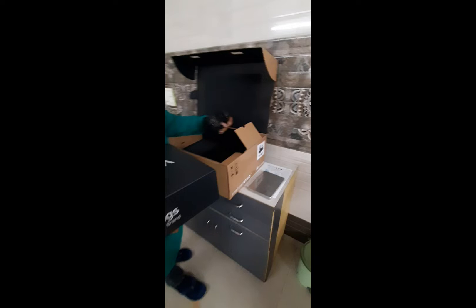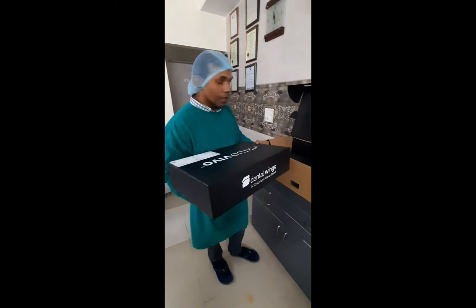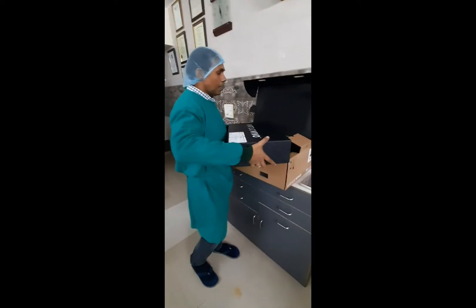You have something here as well — this is the charger and here you have the adapter. I think these are all part of this equipment. Let me just open it up.